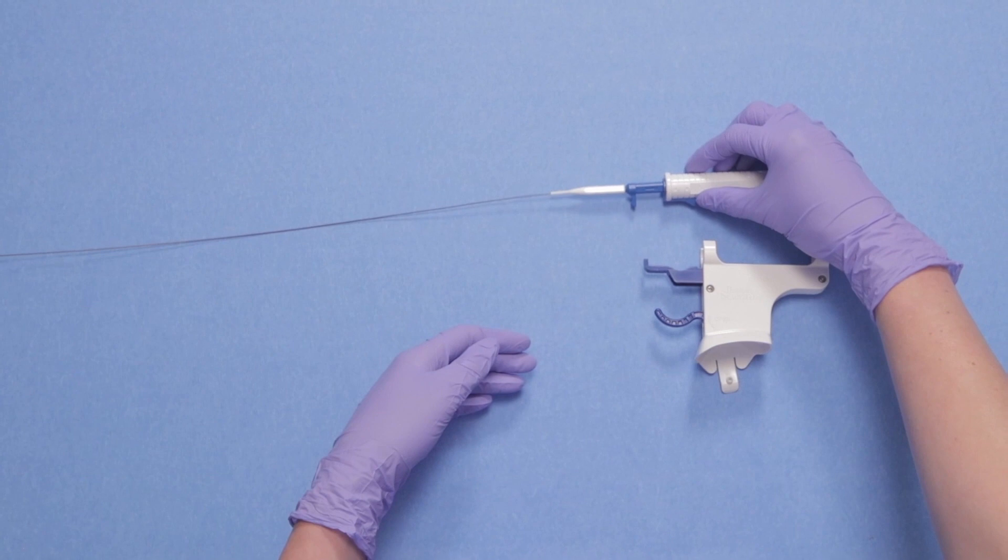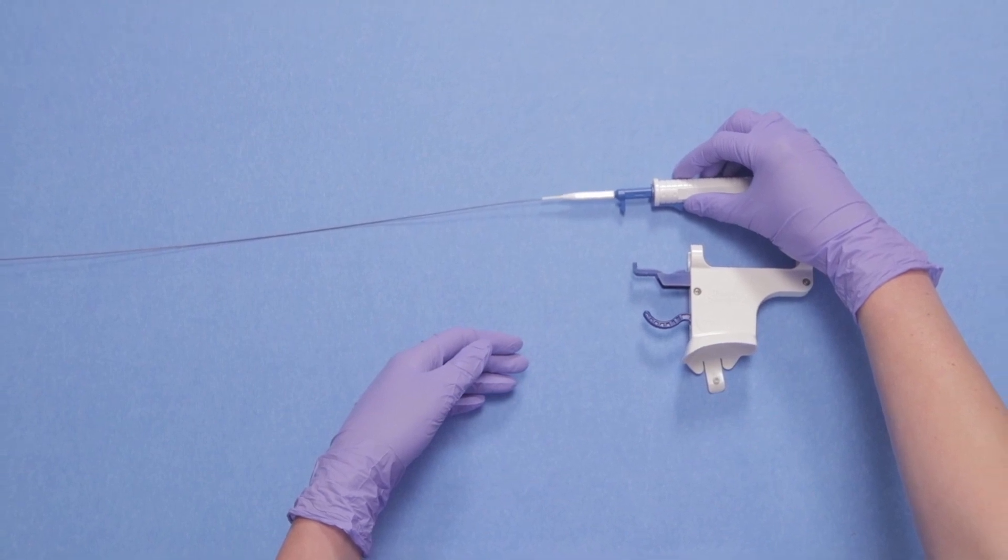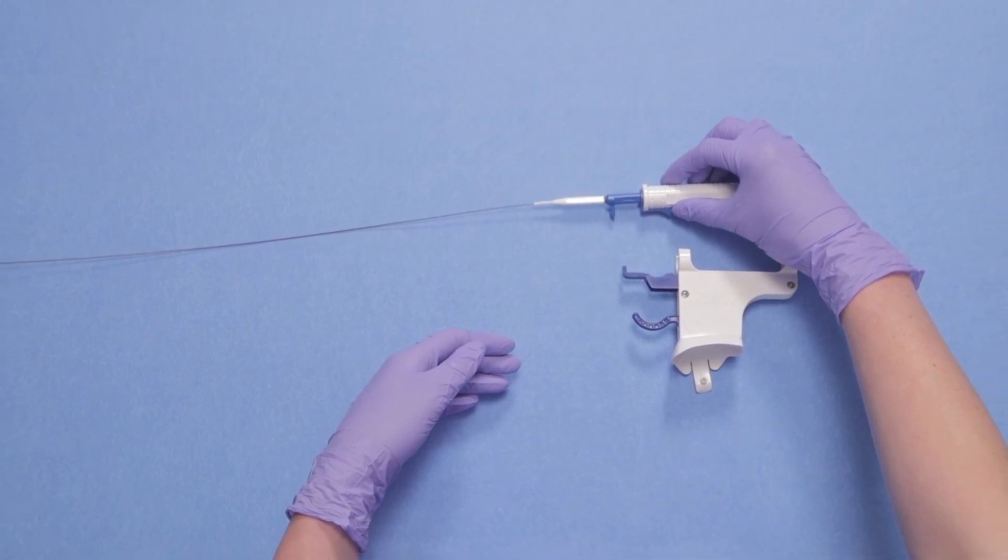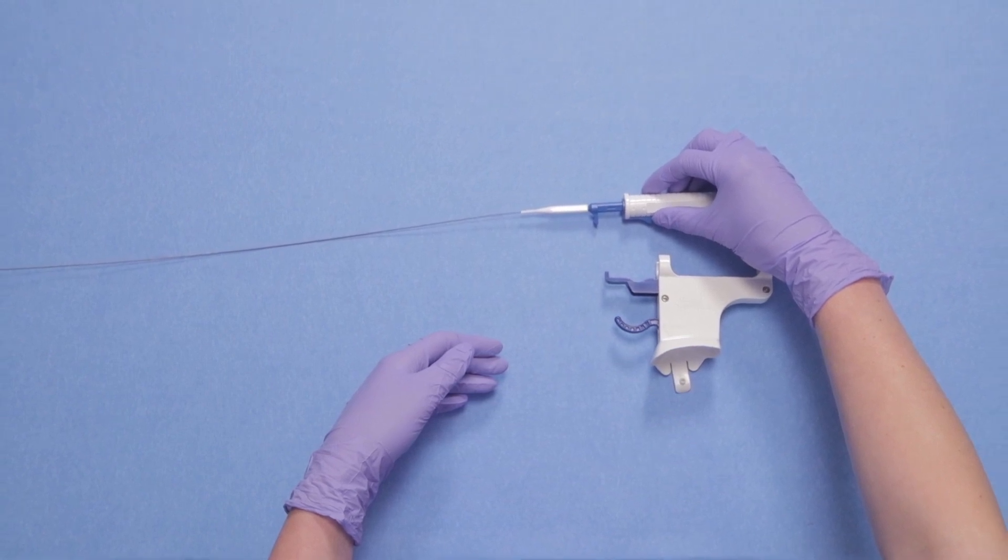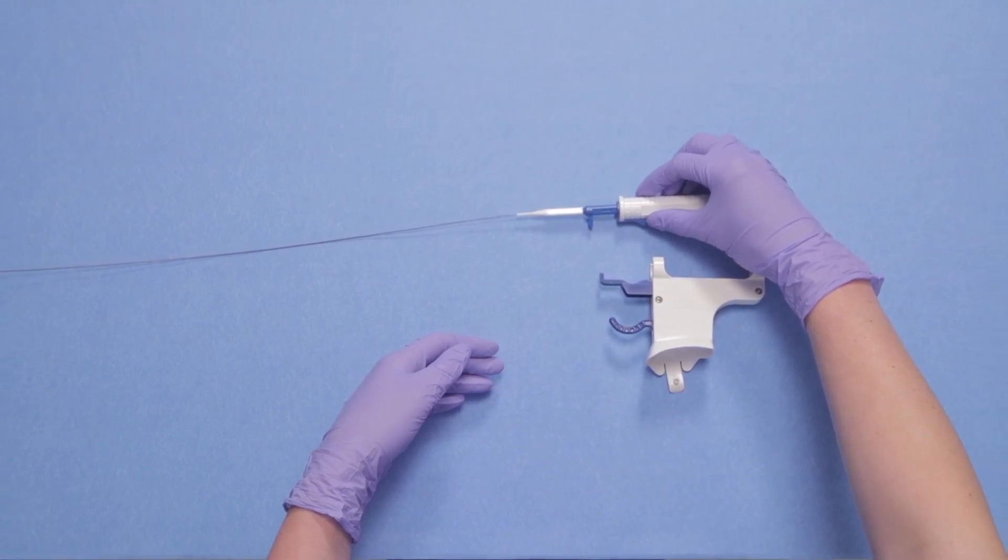Please know that your Boston Scientific basket handle will look different depending on the specific nitinol retrieval device you are using. In this demonstration, we are using the Dakota retrieval device.